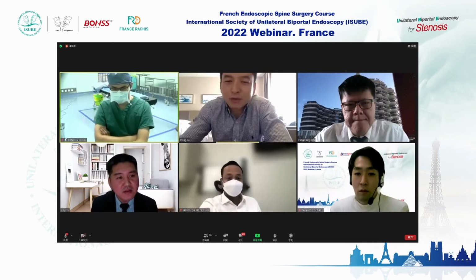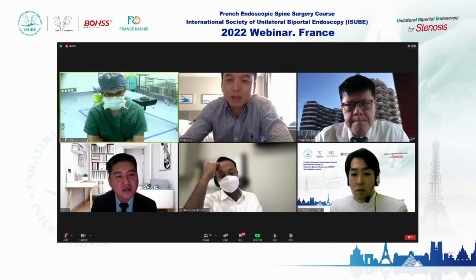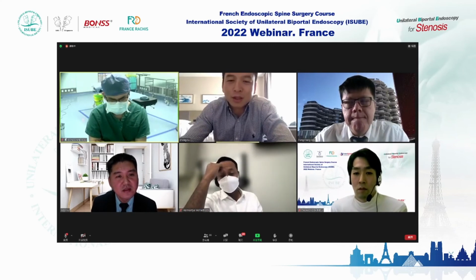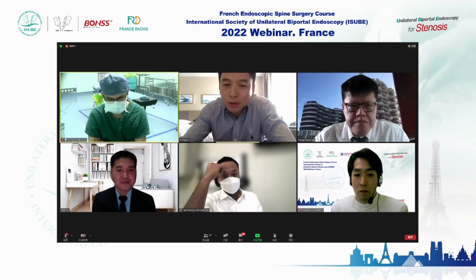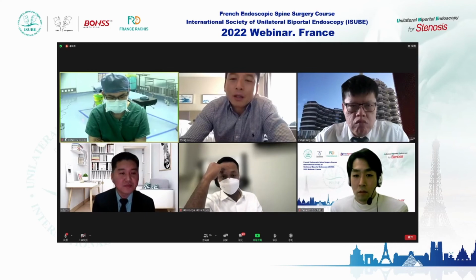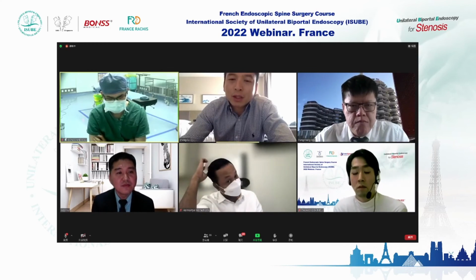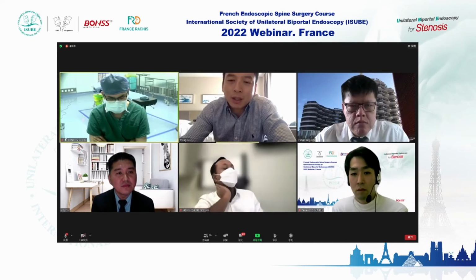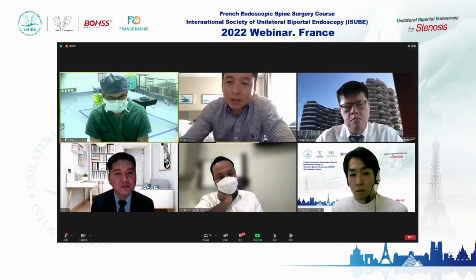I would like to show some cases you could perform early in endoscopic spine surgery, like disc herniation and lateral recess stenosis.